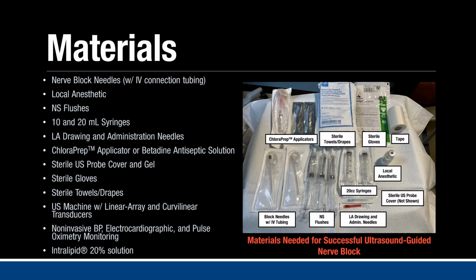These are the materials needed to adequately perform ultrasound-guided nerve blocks, and this is a pretty comprehensive list. Some points worth highlighting. So firstly, with any procedure, setup is key to ensure optimal performance and to maximize your probability of success. You want to ensure that you have all the necessary supplies readily available prior to commencing the procedure. Perhaps most important to success is utilization of an echogenic short bevel blunt tip needle.